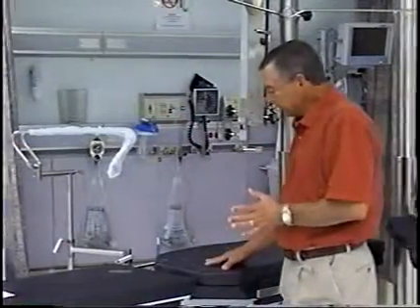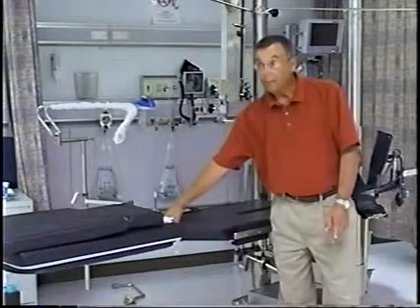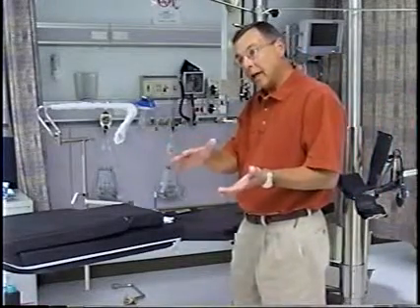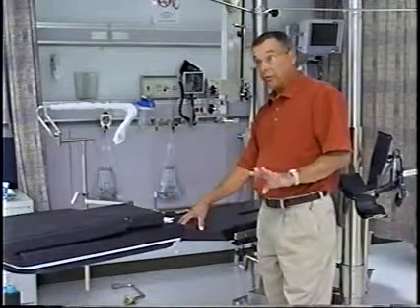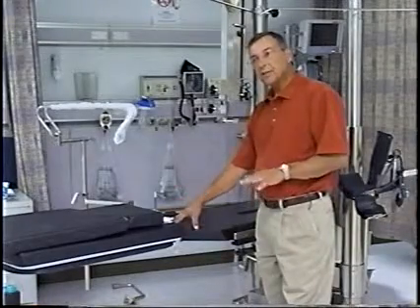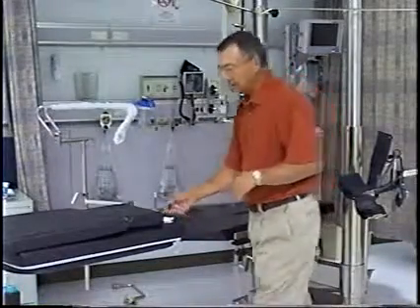Couple things about the table. The only metal in the top of the table is the 3 inches right at the very perineal edge. Everything else is carbon fiber. So if the doc wants to do an oblique shot for some reason, he can. The table will support and articulate a 400 pound patient. So you don't have to worry about the table tipping or the board breaking, and this has been tested to 3 times 400 pounds. So we know it's going to hold a 400 or 1,200 pound patient. Probably never going to get that.